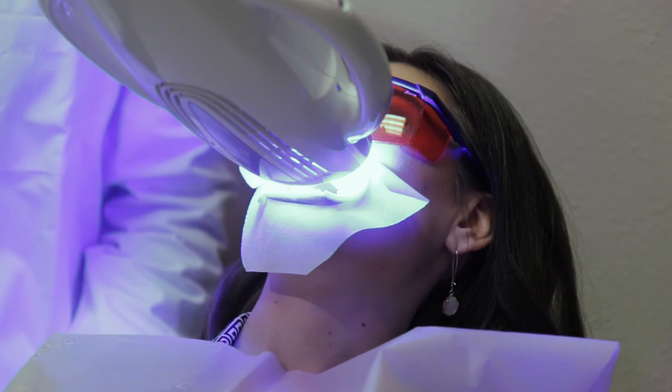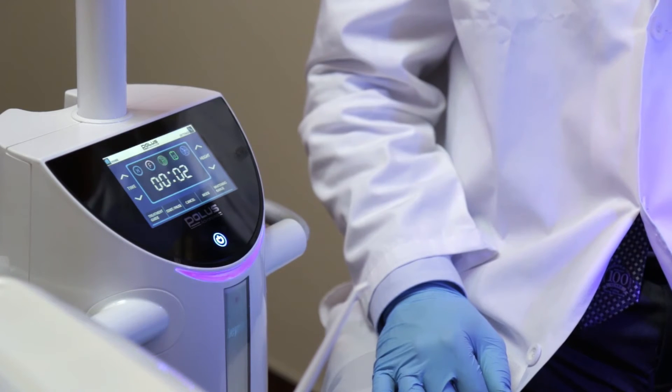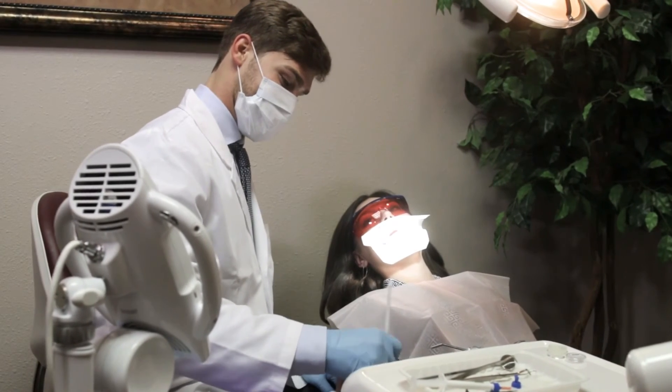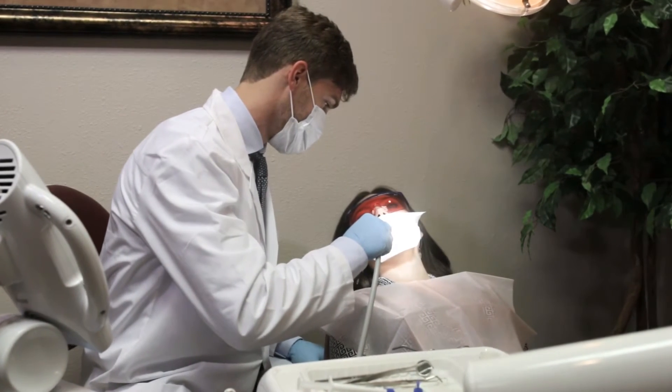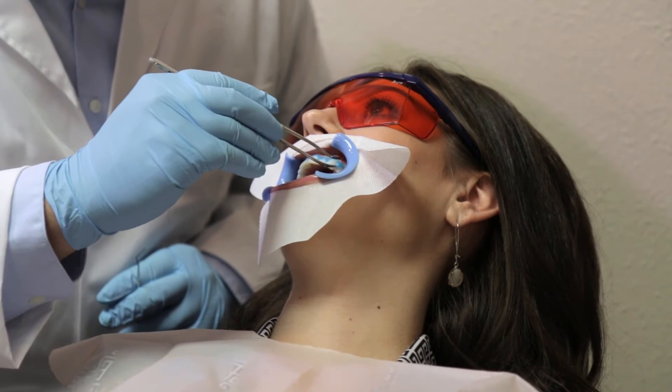At the end of the first cycle, the light will turn off automatically. Use suction to remove the whitening gel. Do not rinse with water. Repeat the gel and light application steps two more times for a total of three treatment cycles. After the final cycle, suction off the whitening gel.